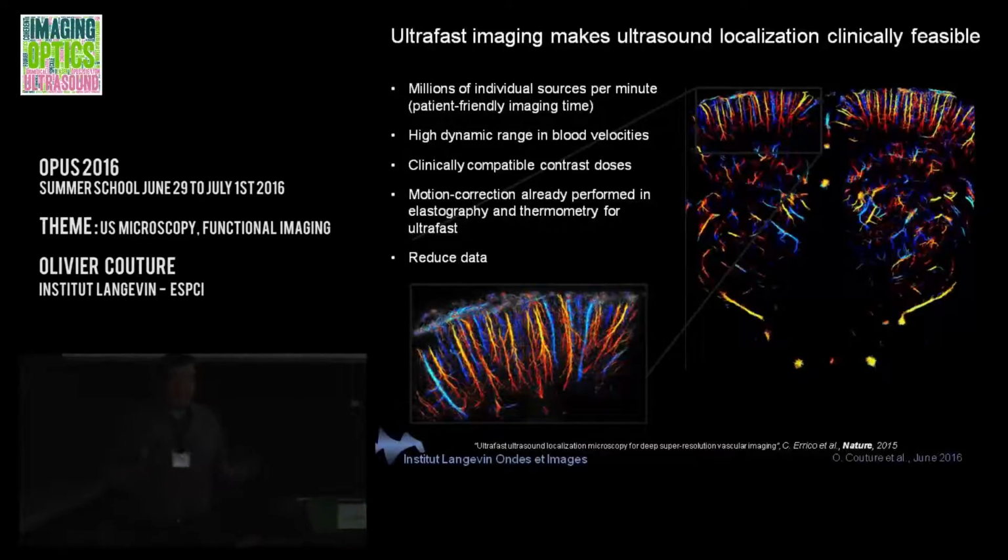Obviously we're limited by a few things. The time of acquisition, obviously. Motion correction will have to be implemented, but that's something that we're currently working on. And obviously it's a very, very large stack of data. We acquire easily 50 gigabytes of data every minute, so that's something that we have to process. So maybe it takes 3 minutes to acquire the data, but it takes a few hours to process it currently. But we hope that with Moore's law, eventually this will become shorter and shorter.